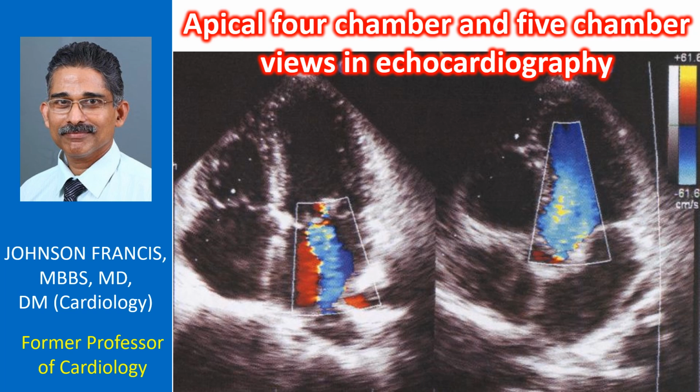The blue flow into the left ventricular outflow tract is the forward flow into the aorta, and it can be seen just crossing the partially open aortic valve.